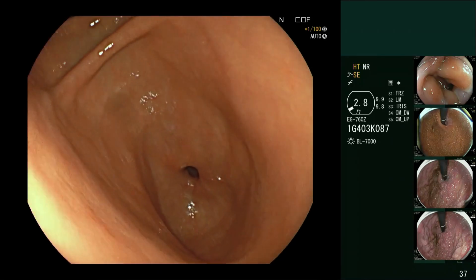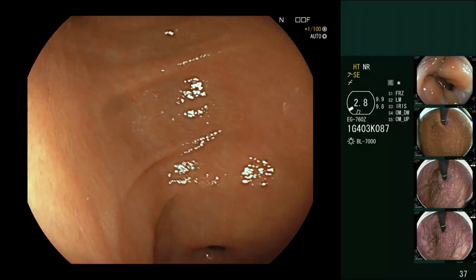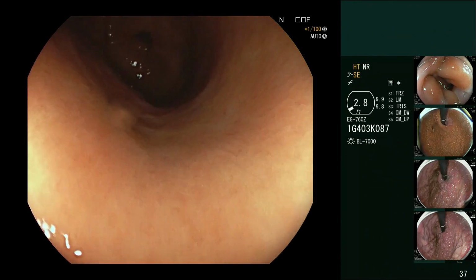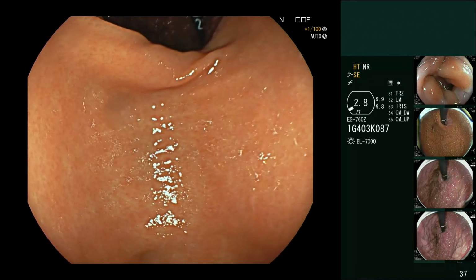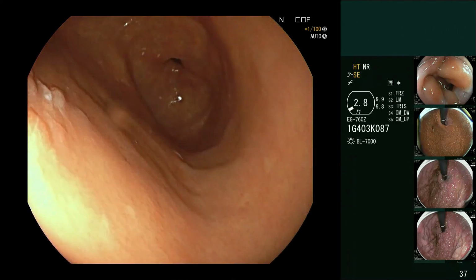That involves for me a careful look in white light, and we're looking for areas of extra redness. On the lens of this endoscope there's a little imperfection, which please ignore. But for the rest I think it's a really beautiful, high resolution image from this Fujifilm endoscope. So what you're looking for is extra redness. You're looking for any areas of depression, and I really think that you need to be structured about how you do these things.